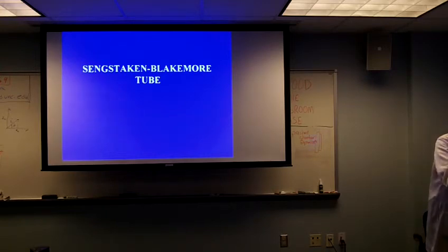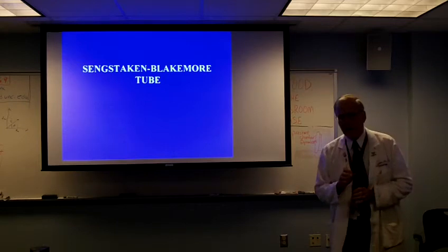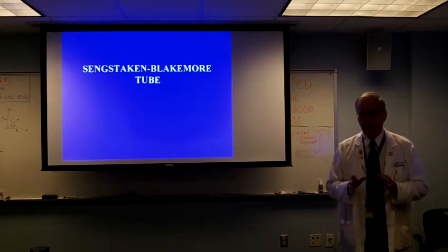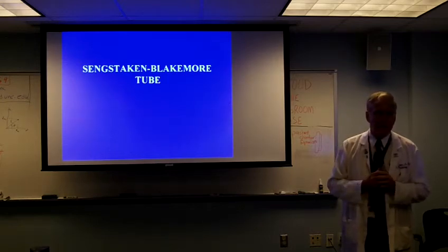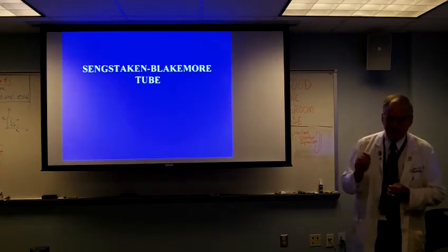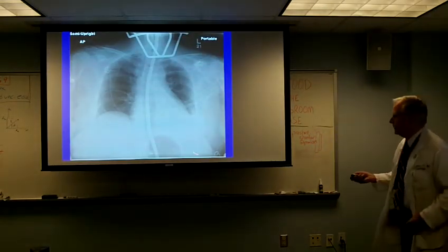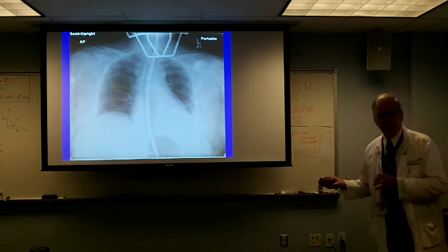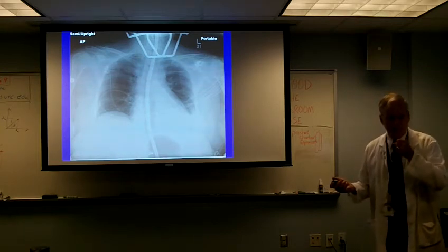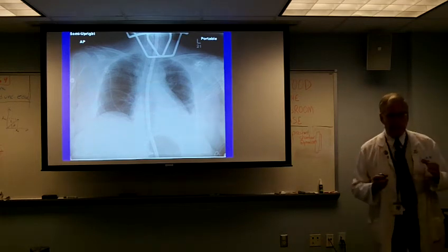We still see this occasionally, maybe 2 or 3 times a year. This device, and it's in the handout, was designed to be a temporizing measure in patients who came in with portal hypertension and bleeding esophageal varices. And what it does is you put the tube down into the stomach where there is a balloon that you inflate. And when that balloon is inflated, you pull the tube back up against the GE junction. And then you inflate the esophageal balloon so that it compresses the varices.